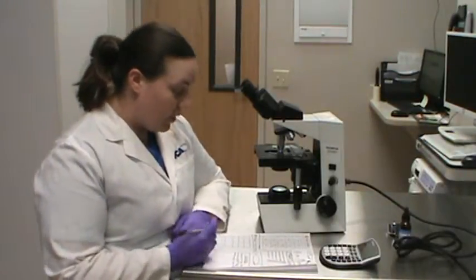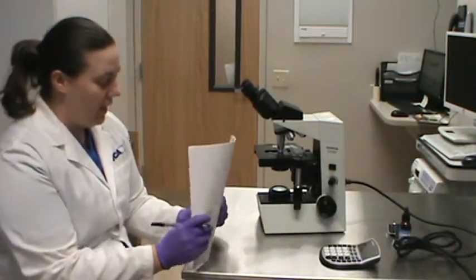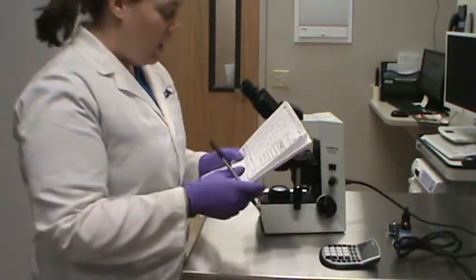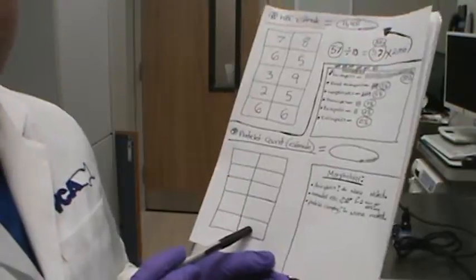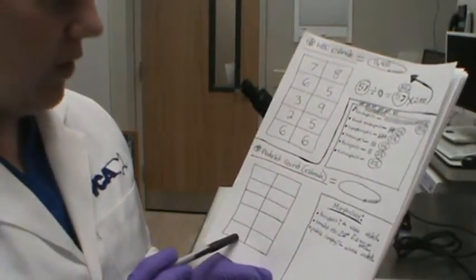So the last part of this section, I'm going to do a platelet count, similar to what we did earlier with our white blood cell estimate. Same kind of concept. We have 10 boxes, which represent the 10 fields that we view.